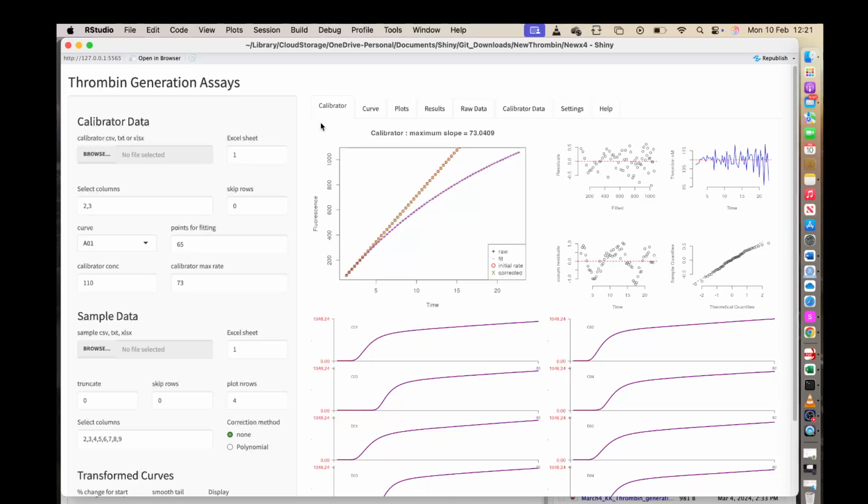This is useful if data from different laboratories are to be compared using a common analysis method, thus focusing attention on differences arising from the assay conditions. Another driver for the app was to present a transparent way of using your own data with selected settings, tuned to your own needs, rather than a black box where data were fed in at one end and results appear at the other. Because the app allows for changes in default settings, it is important to consider what effects your own selections have on the outcome of your results.